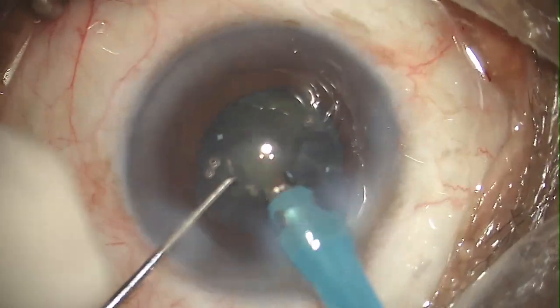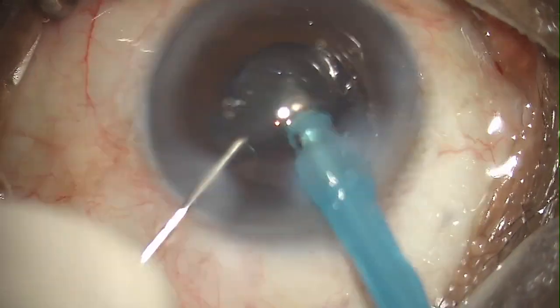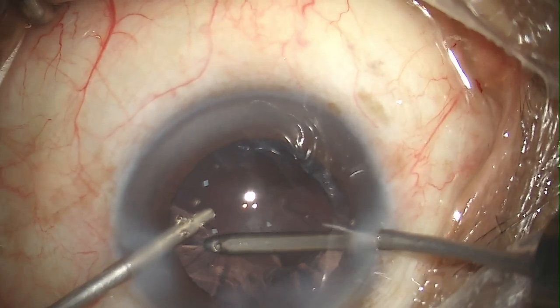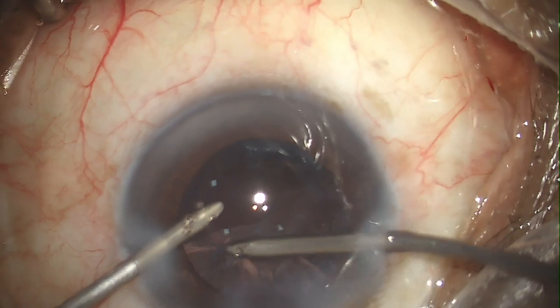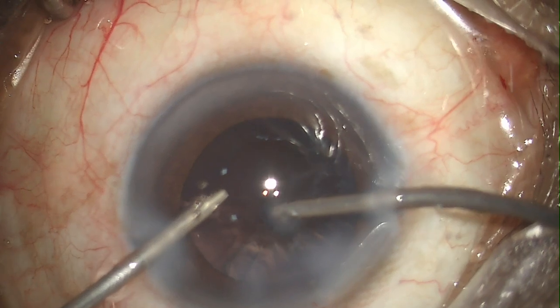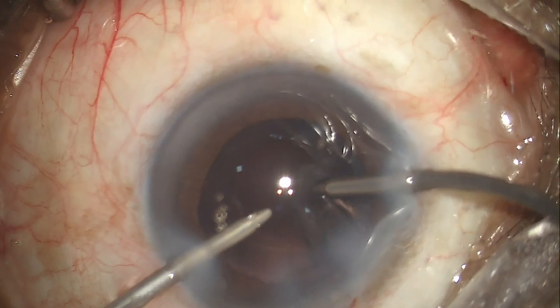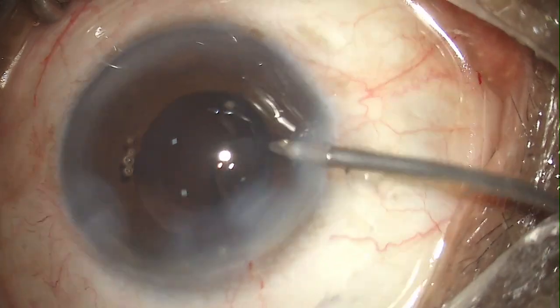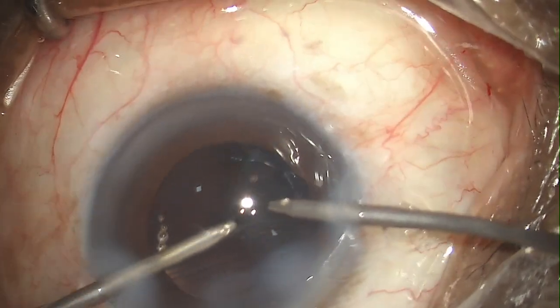Here I'm almost done with the nucleus — just the epinucleus plate is remaining, and even that's done. What we are left with is just cortex. I usually prefer a bimanual I&A probe to remove the cortex. It's much more controlled, and subincisional cortex is much more easily removed compared to the coaxial one. Just one more piece of cortex remaining, and even that's done.